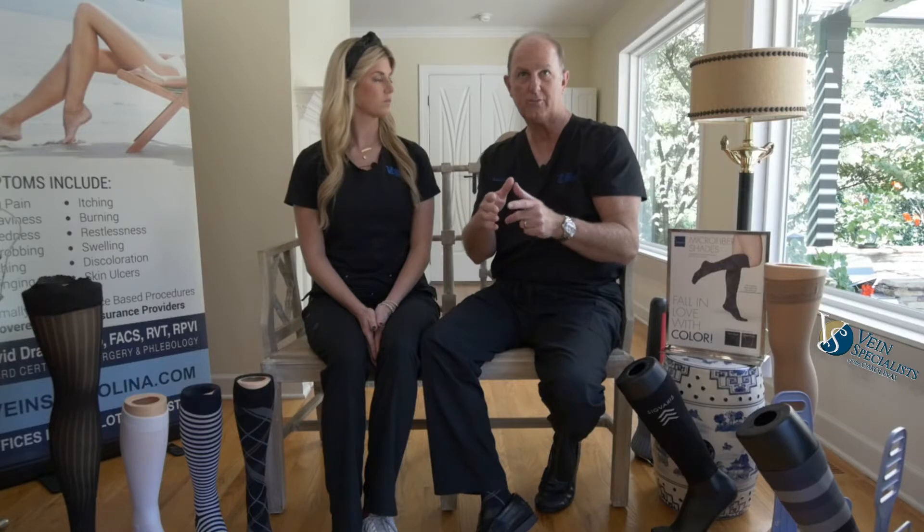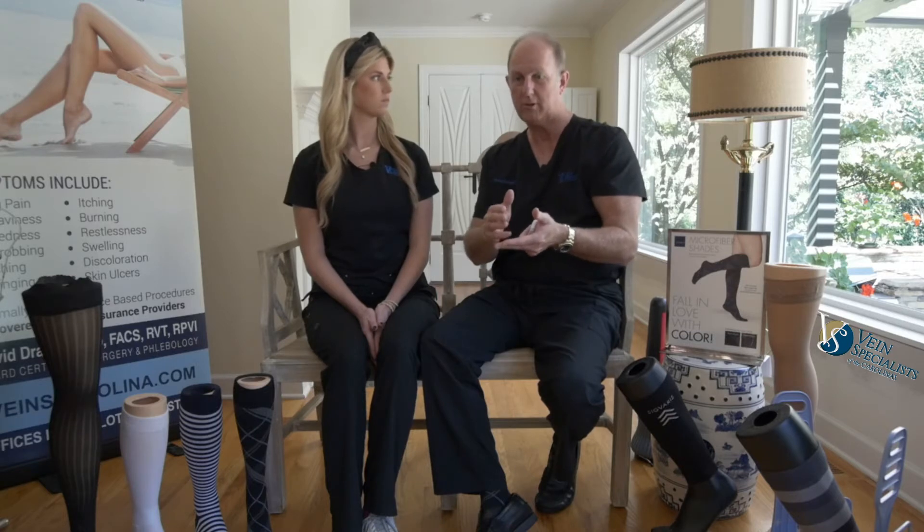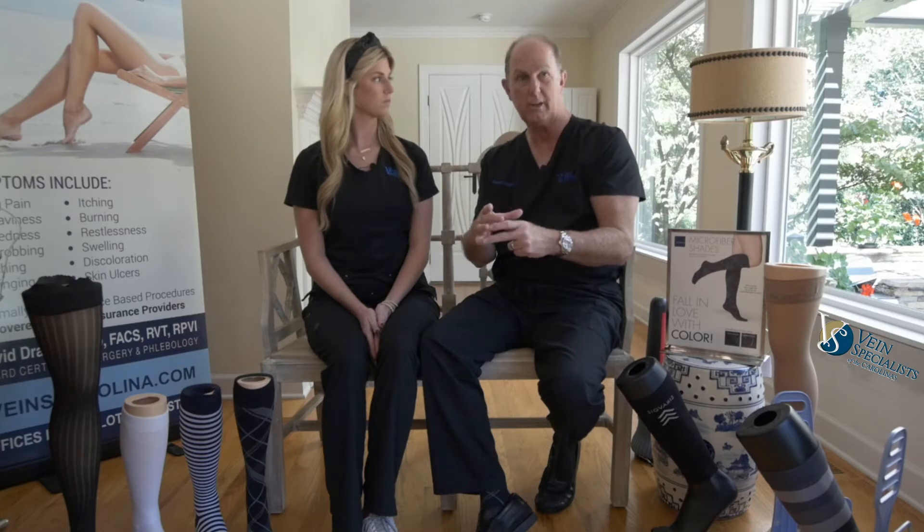The reason we say garments are 20 to 30 is that if your leg is large for that size — close to the largest that size can tolerate — your pressure will be more like 30. If your leg is small for that size, then your pressure will be more like 20. So when we talk about garments, we talk about a range of pressure: 20-30, 30-40, 40-50, because we don't know the exact pressure you will get. And if your leg changes size by wearing the garments and swelling goes down, then obviously the pressure will be a little less.